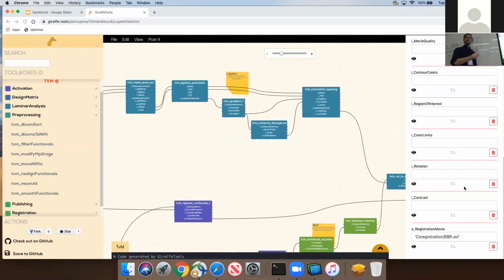This problem is quite standard in fMRI, but then in the temporal domain, because what you're doing in a pretty standard temporal regression is saying, right, I know that my one output signal is a linear superposition of different stimuli, and you're trying to invert that system by means of a temporal regression. And a similar thing you could do, but then in the spatial domain. So that's one of the ways in which we can try and describe this.